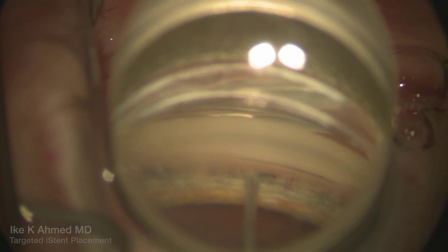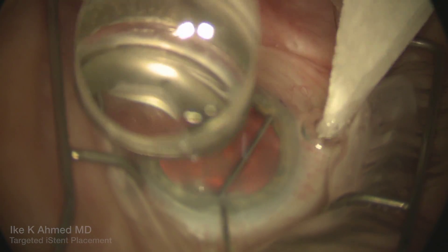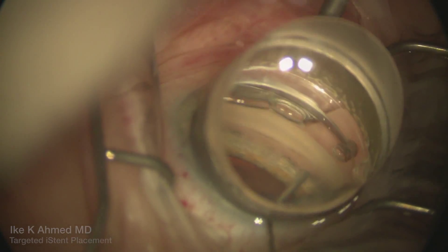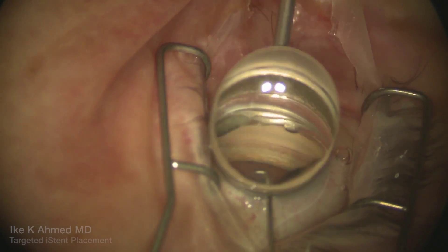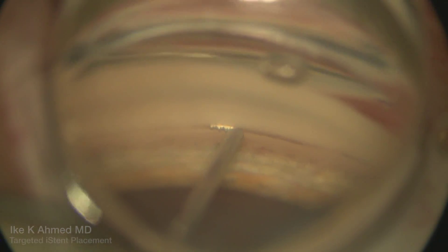Here is the gonioscopic corresponding image where those marks have been placed. It's at these marks where we're going to plan on placing, in this case, two eye stents to be placed directly where we feel those aqueous vein systems are present.